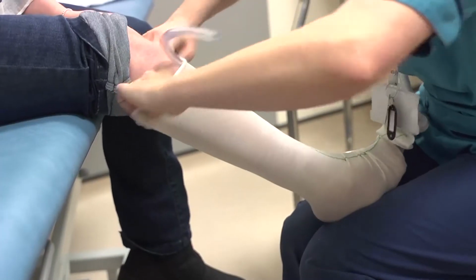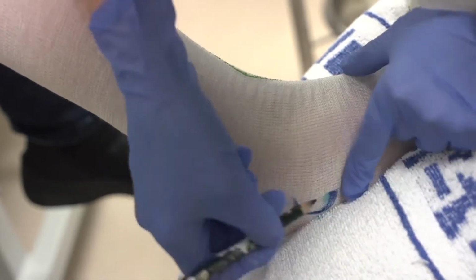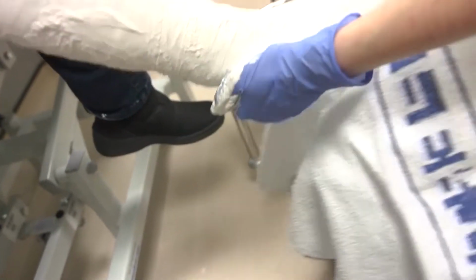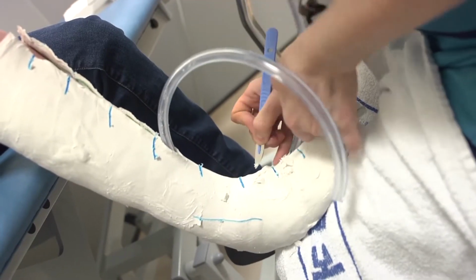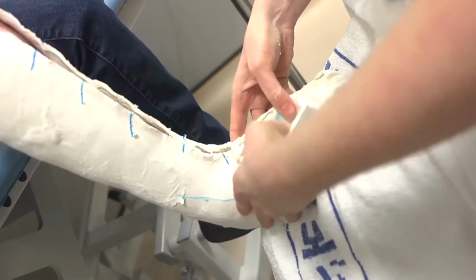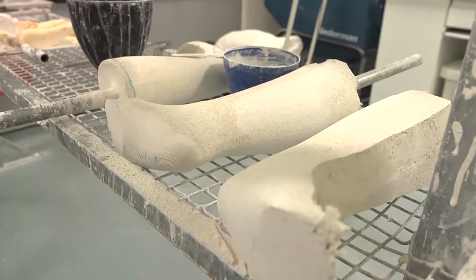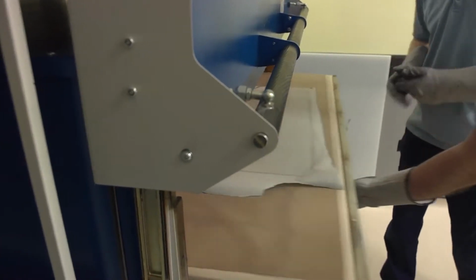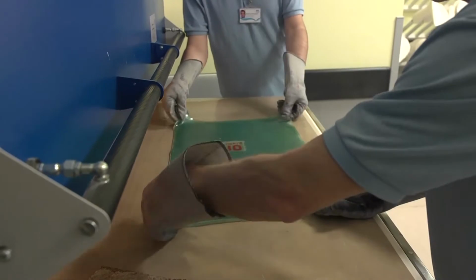From start to finish, the patient will be assessed, and we decide that they need an AFO, an ankle foot orthosis. That process starts with taking the shape from the patient. Having taken that shape, let's say it was a cast, that cast is then filled and a mould created. That mould is then adapted and adjusted. It is moulded in plastic generally, or foam, sometimes metal and leather can be used as well.